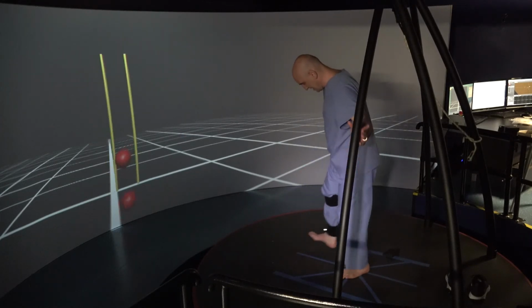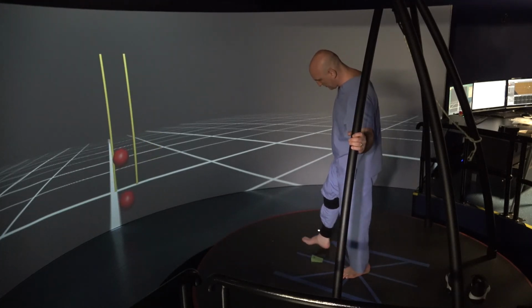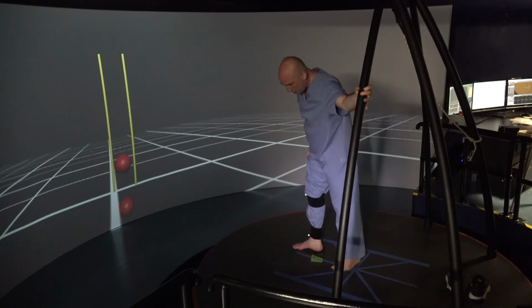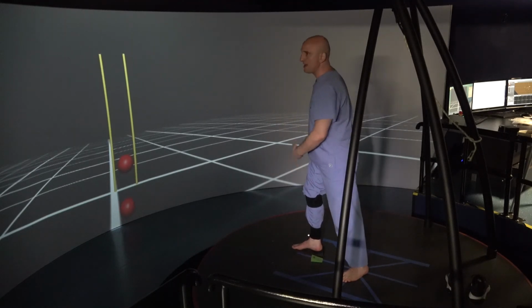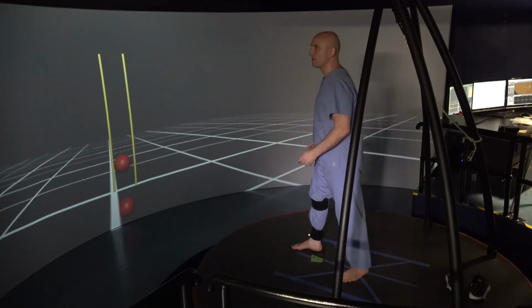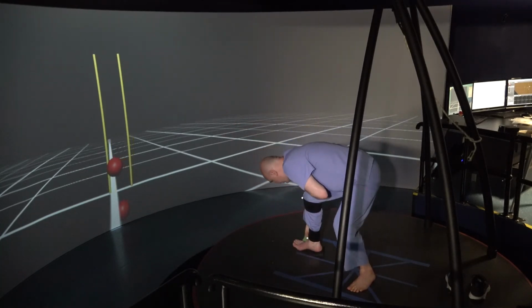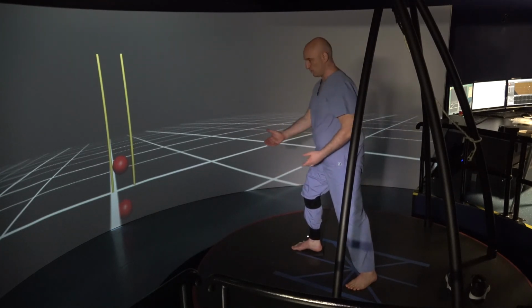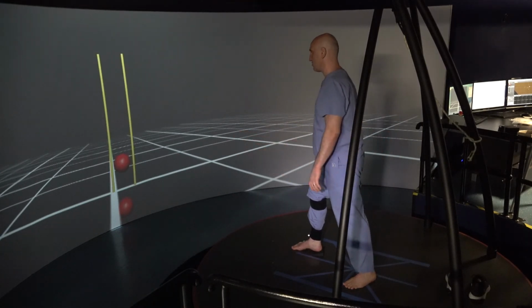This gives direct feedback, but what we can also do is change someone's biomechanics by putting wedges under the foot, so changing loading. Now if I lift my heel, I have more ankle dorsiflexion this way. Now you can see how, without trying, I'm going in, which is what I should. And if I put another wedge under my fifth toe, the fifth metatarsal, I'm already valgus, which is what I should be. And then if I bend, I know exactly what's going on.